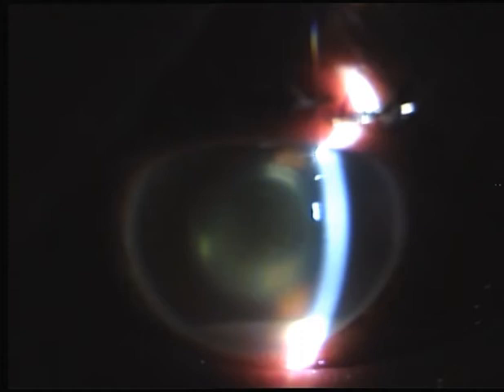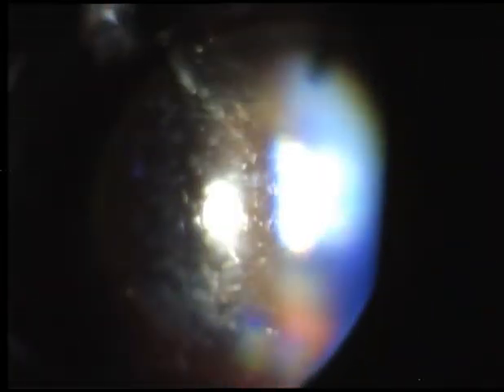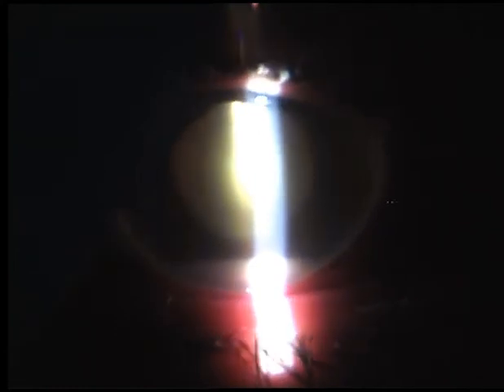Let's go through these findings as the video plays and see if you can recognize all of them. Moving forward, I'm doing retro-illumination — you've got a mild degree of red reflex but not a very brilliant one. I'm trying to see the fundus, but the 90D lens does not give me a clear view because of the hazy anterior chamber and the vitreous as well.